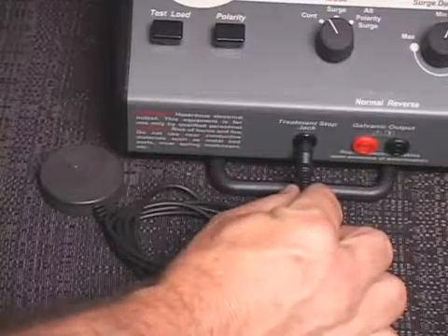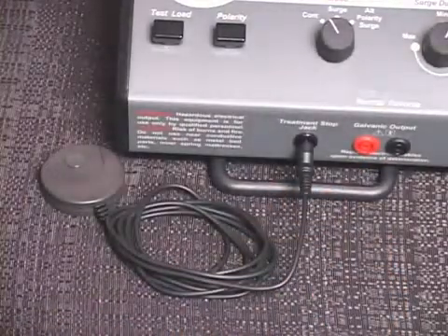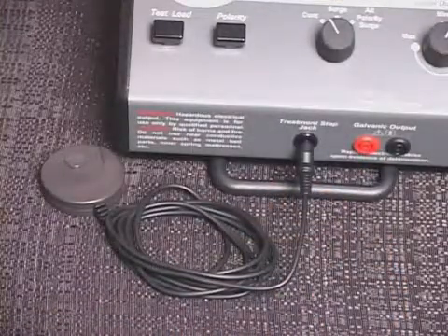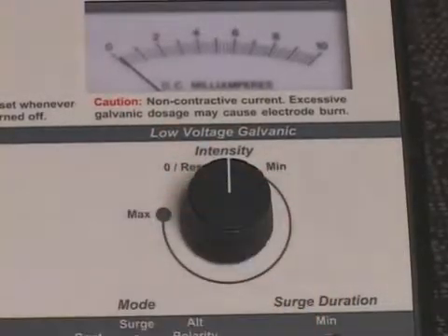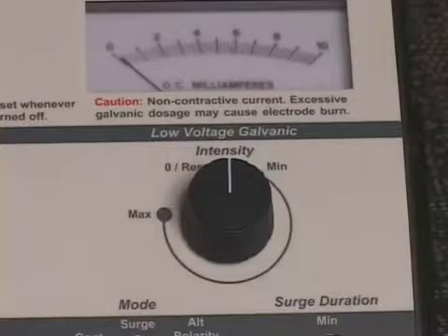Connect the patient treatment stop switch to the treatment stop jack. Rotate the intensity control knob to the zero reset position, enabling the audible click. The LVG325A is equipped with an intensity reset circuit feature. This feature prevents the practitioner from applying one patient's intensity setting to another patient.